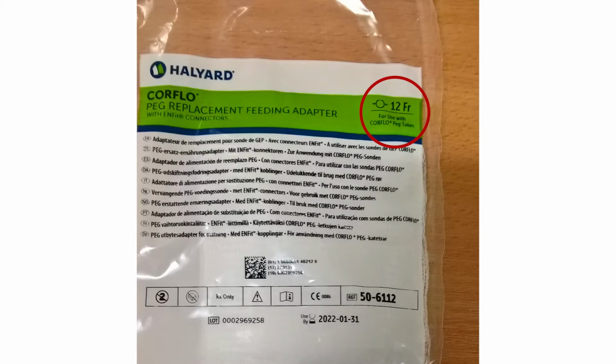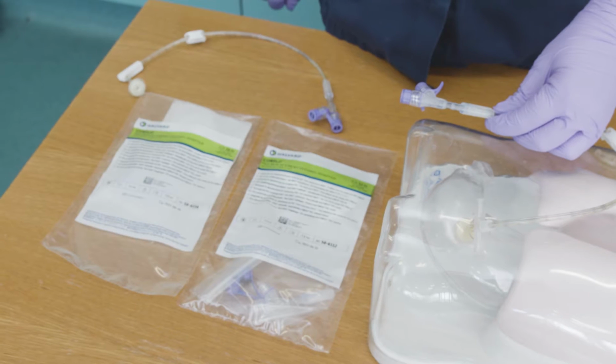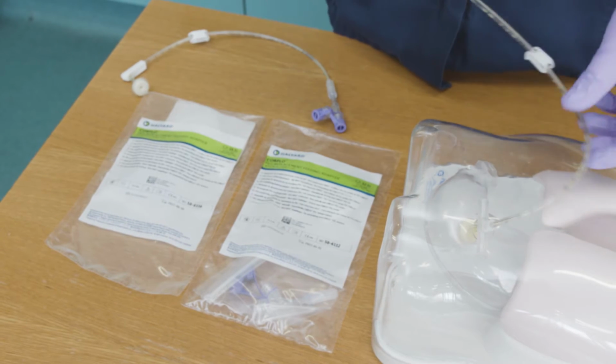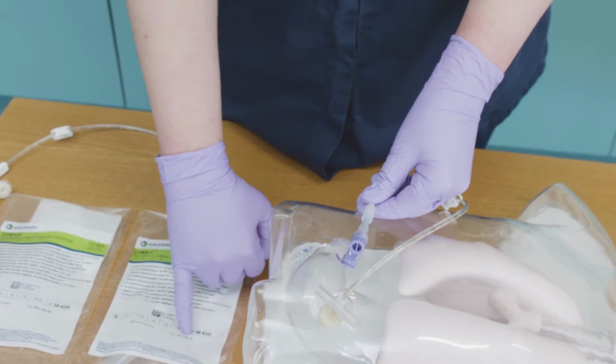The sizes are 12 French or 16 French. The size of the tube should be shown on the tube itself. Check that the new Y adapter is within its expiry date.